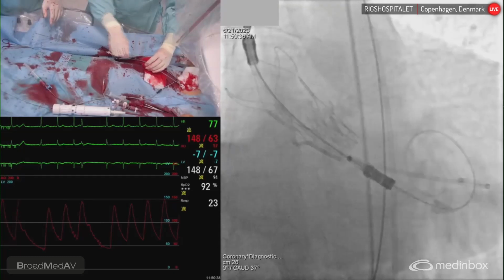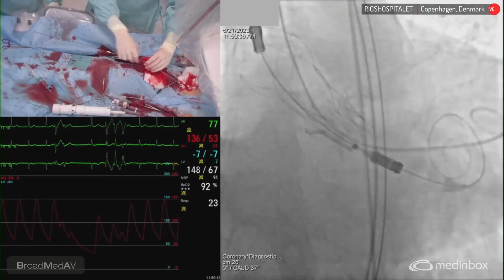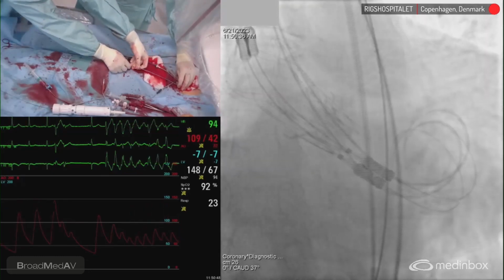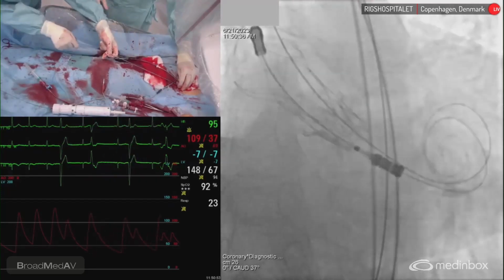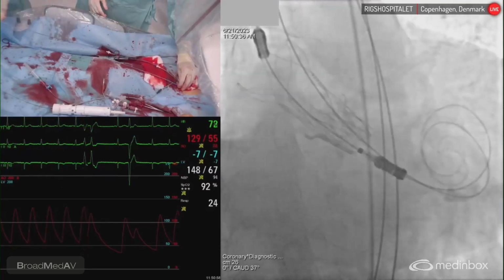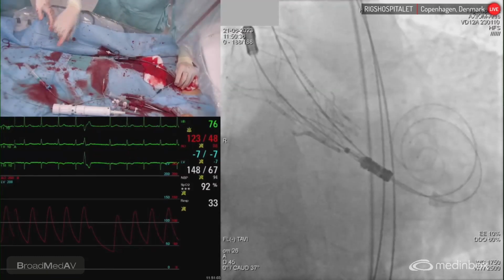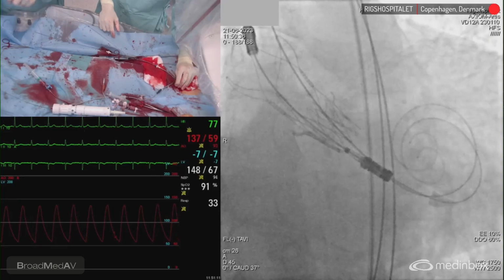Balloon is ready, please. All right, good. Walk it out, a bit careful. Push your wire. Don't lose it. Yeah, that's good. Keep on going. All right, so balloon ready then. I have the wire. Balloon on. I think this is the safest way to do it.